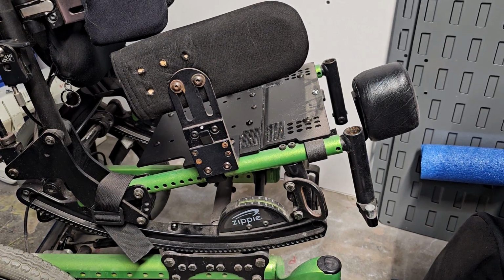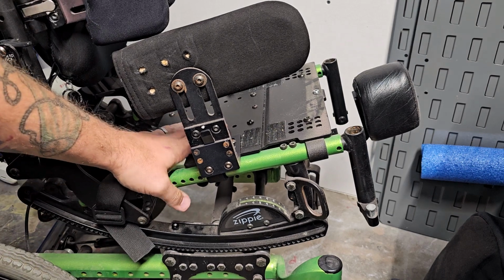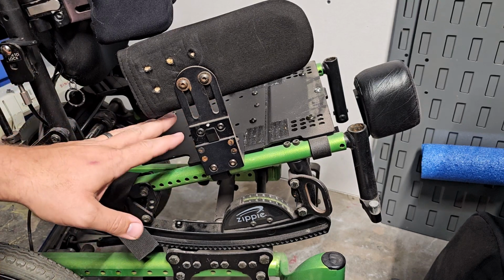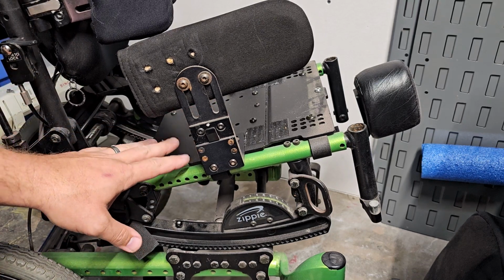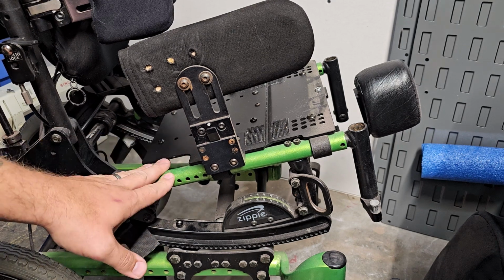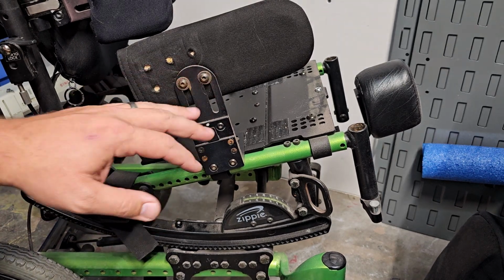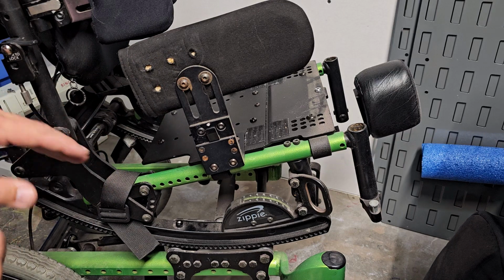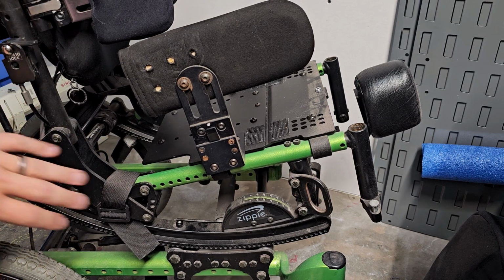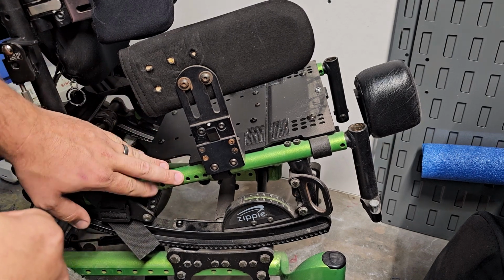Okay, now we'll go over mounting the bracket to the wheelchair. I had taken the seat off of this wheelchair to make it a little easier, but it will depend on your wheelchair and your user where you mount them. Some mount them down here on this bar, some have mounted them on their laterals or hip laterals, then some have mounted them up on this bar, but today where I prefer to mount them is right here.